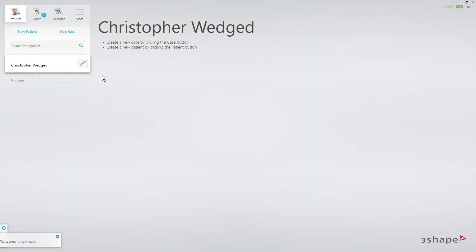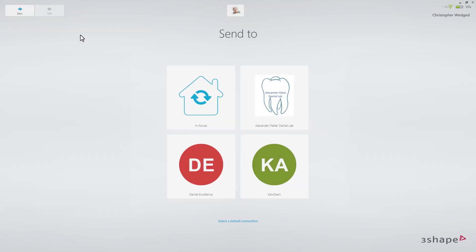This video will demonstrate the workflow for an inlay, onlay, and veneer. On the patient's page, click New Case. Next, select a lab.